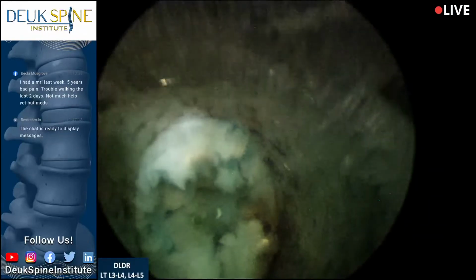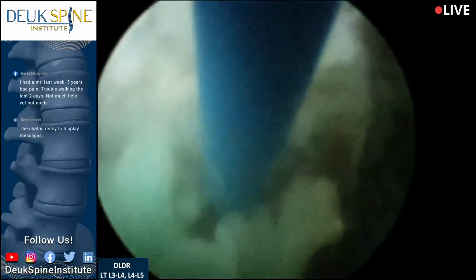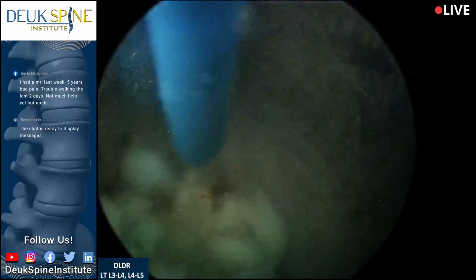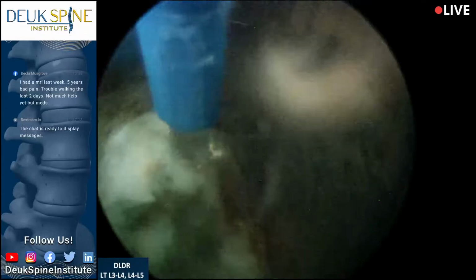What I have to do is laser it first to release it, because otherwise it's stuck together. Once the laser's done doing its job, I put the grabber down and pull out the loose pieces that have been freed up from the laser. All right, any questions? No current questions.